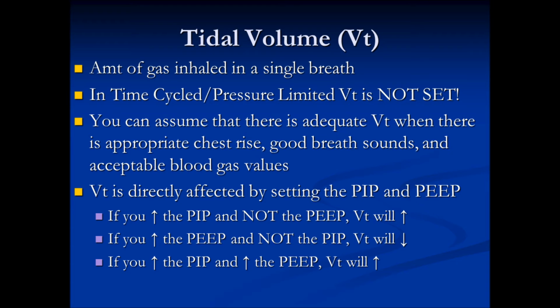You always want to focus on those 4 life functions. Ventilation is first and foremost. So if you have a problem with ventilation, look for the option that will allow you to manipulate ventilation. If they are going to give you both options, then they won't give you ventilation by itself, oxygenation by itself, and then an option for ventilation and oxygenation. If they want you to make both changes at the same time, that's the only option they're going to give you regarding that. So back to my increased PIP and increased PEEP scenario.